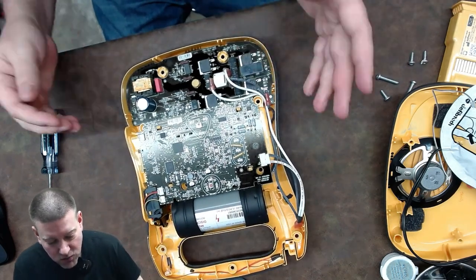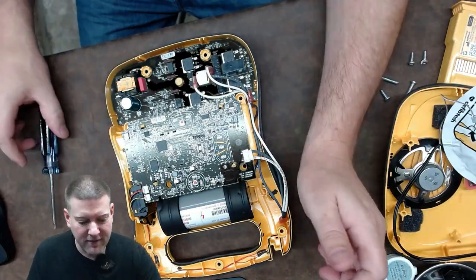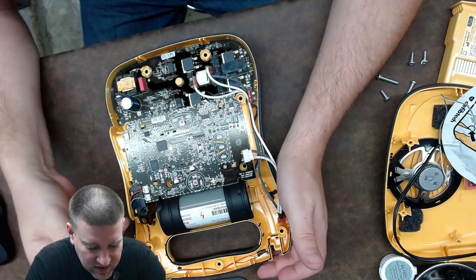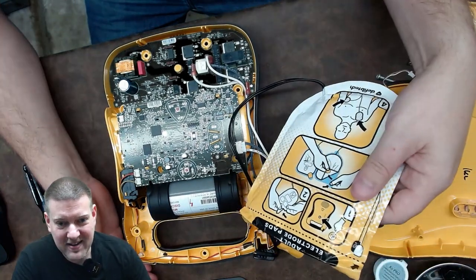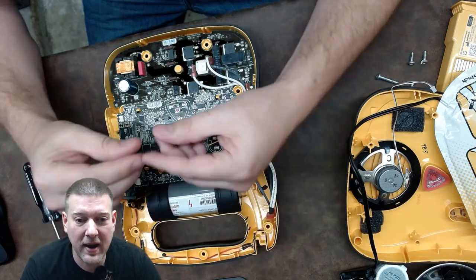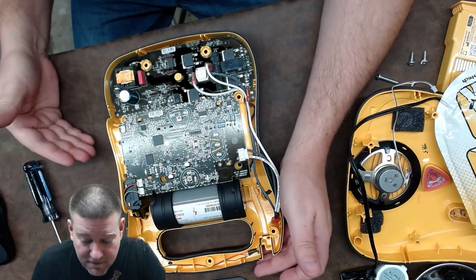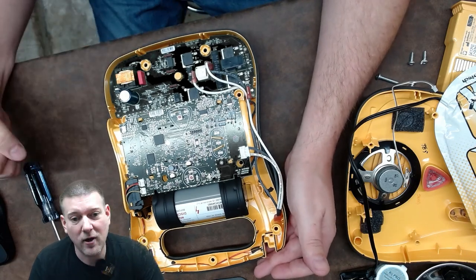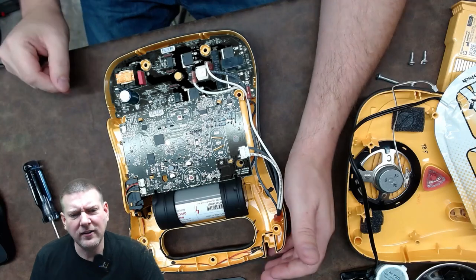This is a very simple device and there's no real need to disassemble it further — that's it. Some AEDs have an LCD controller, but everything on this one is done through verbal commands, status LEDs, and the pads. It monitors the pads, which monitor the patient. The bottom board strictly takes the battery voltage and steps it up to the amount needed. Defibs don't deliver a huge amount of current — it's a large amount of energy in a very short time, kind of like static electricity.